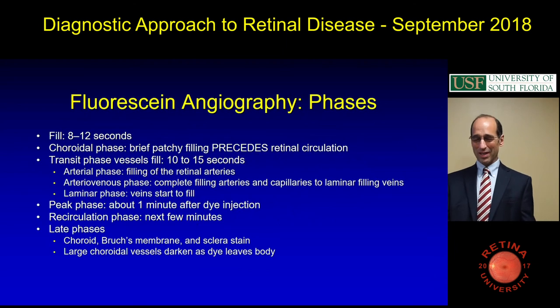Howard Schatz, who I think is still alive, was an excellent teacher who had books on retina decades ago, used to teach fluorescein different from what we do it, but he would say in the early fluorescein image is your intravascular, and in the late image is your extravascular, and it's a nice way to think about it physiologically. And so what's happening is in the late you're seeing the stuff that leaks out and everything else washes out.